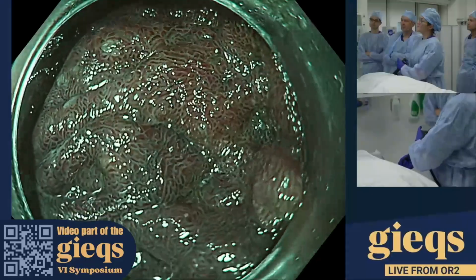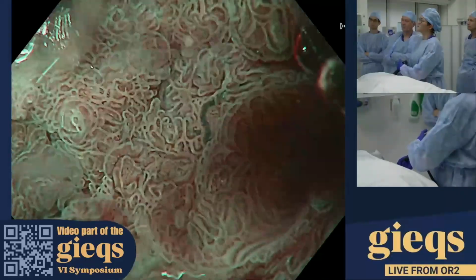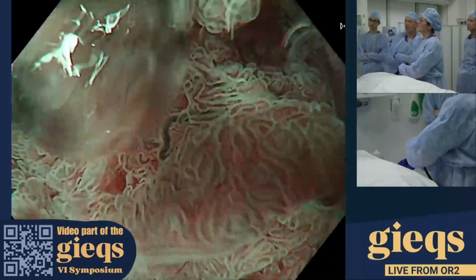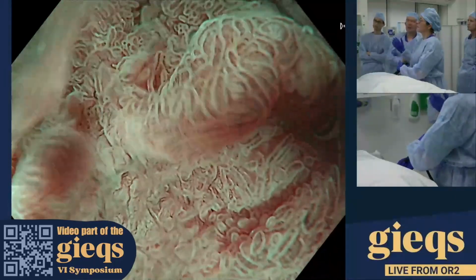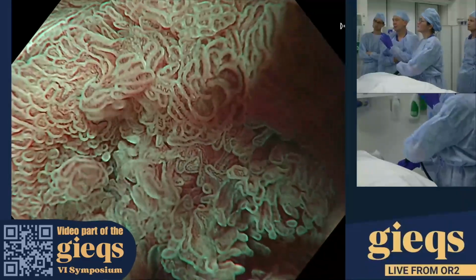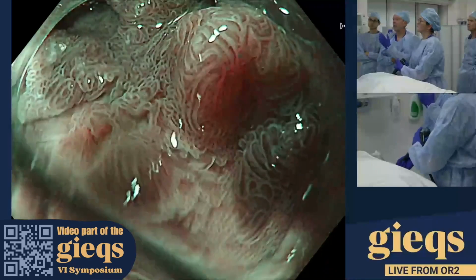And so here there are these areas where you want to get up close, and I was considering doing it underwater. Perfect. You very nicely see that this really helps. I'm just going to pick out a couple of key sentences you said. The first thing is, Ruth is doing this really slowly, and she's gentle. She's got the cap on, and the cap definitely helps.